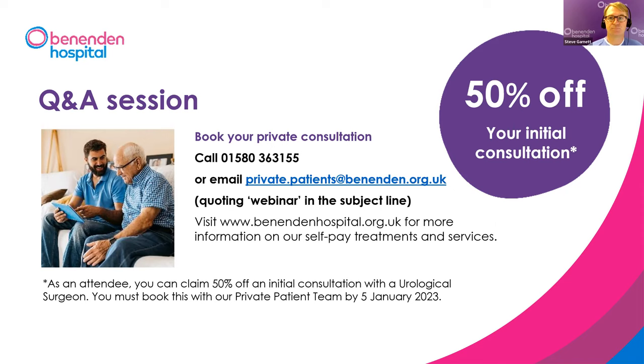Okay. And can Urolift ever be reversed if a different treatment is needed in future years? And has this ever been done? Yep. As I indicated, a number of men will have Urolift and then go on to need further treatment. And you can still have further treatments, such as TURP or laser surgery, and that can be done after a Urolift, and the internal implants are removed during that procedure.